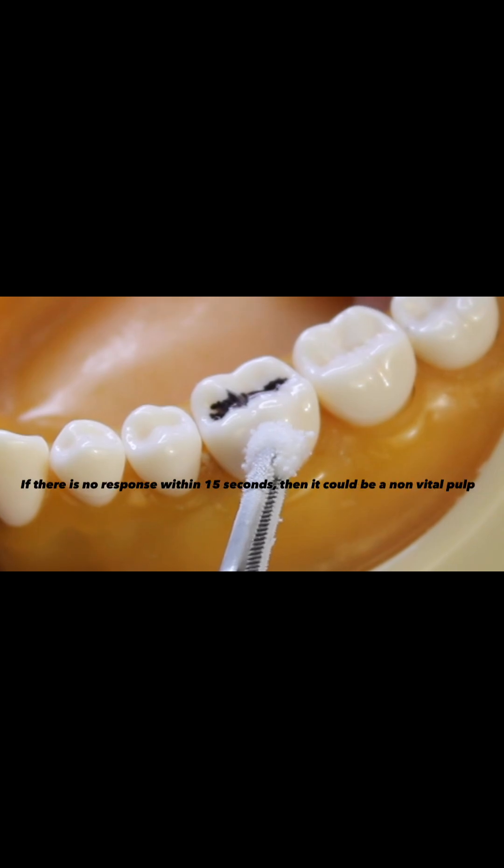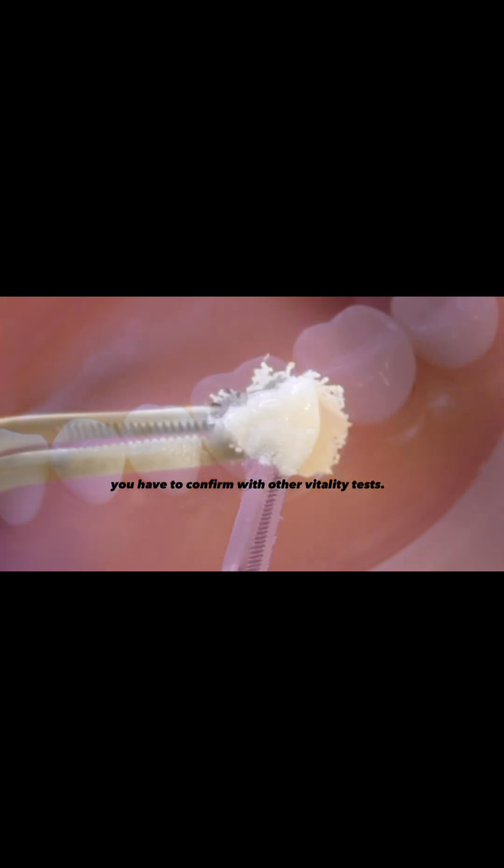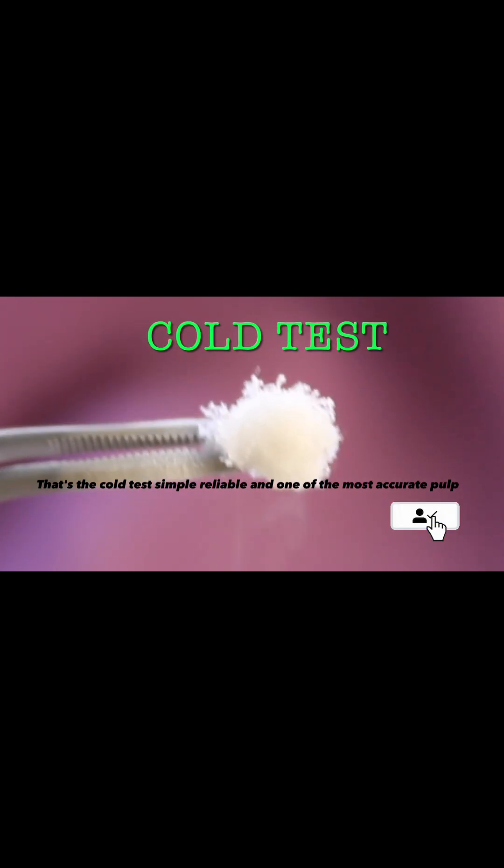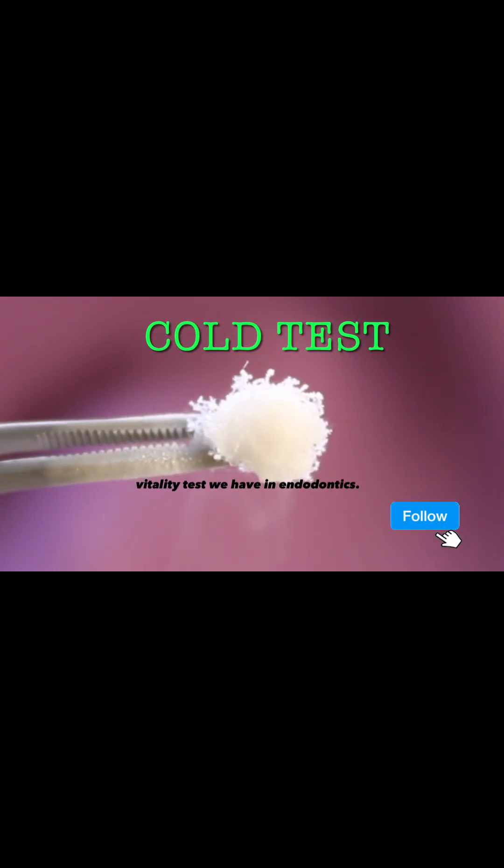If there is no response within 15 seconds, then it could be a non-vital pulp. You have to confirm with other vitality tests. That's the cold test — simple, reliable, and one of the most accurate pulp vitality tests we have in endodontics.